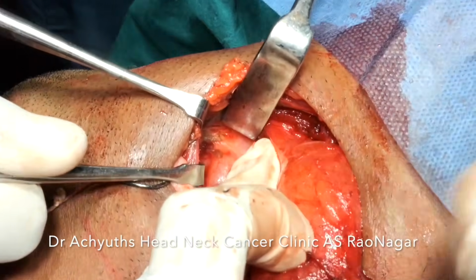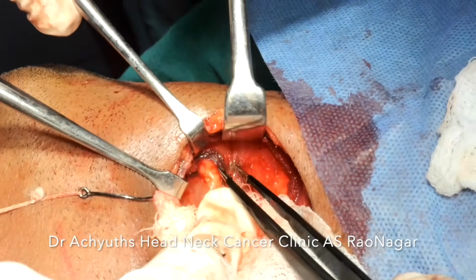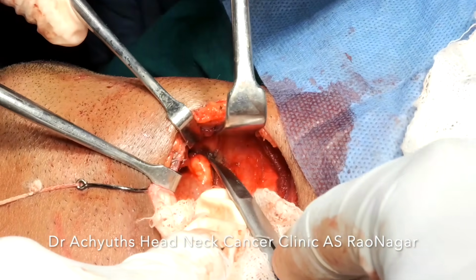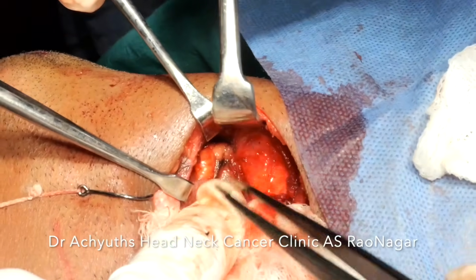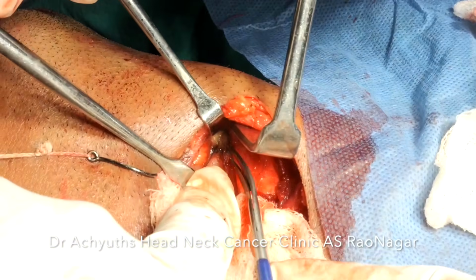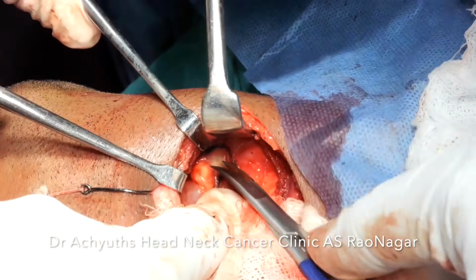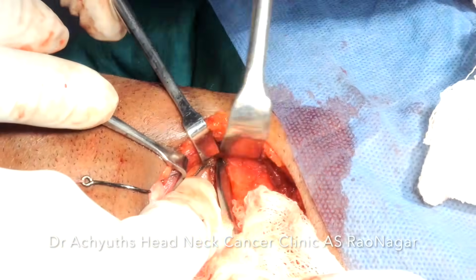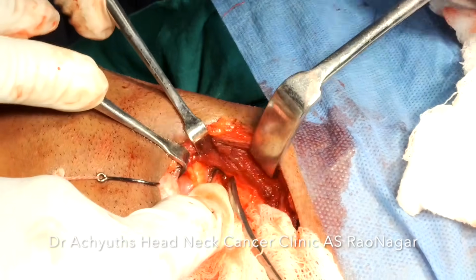Because always the space is being made by the tumor itself. I'm sorry, it is not tumor, it is only cyst. So the cyst by itself makes some space, and we just have to follow the cyst, that's all. We do not make any new connections or communications here. The cyst has already made few communications and we have to follow them just to go inside. So this is the fat from the paraglottic space. That fat need not be divided. You have to divide the fat from the cyst wall, that's all.